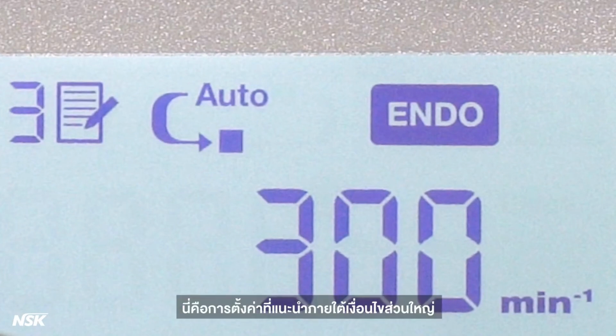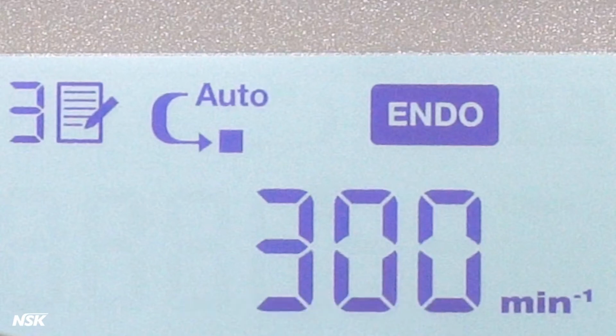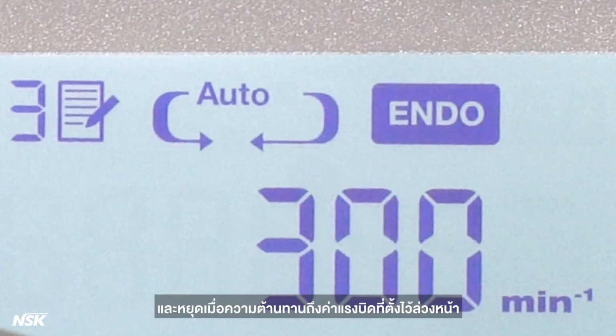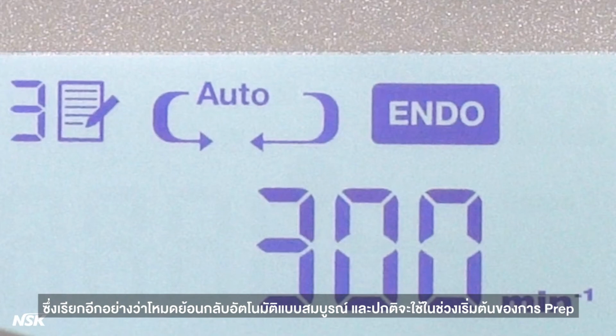This is the setting that is recommended under most conditions. Auto reverse forward means the file rotates down the canal and stops when the resistance reaches the preset torque value and reverses to release the file from that pressure, and repeats the process by rotating down again a second time. This is also called the complete auto reverse mode and is normally used at early stages of the prep.